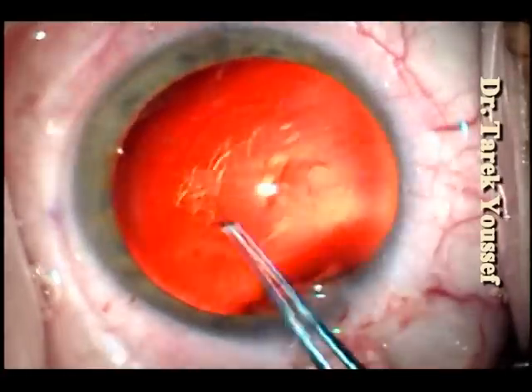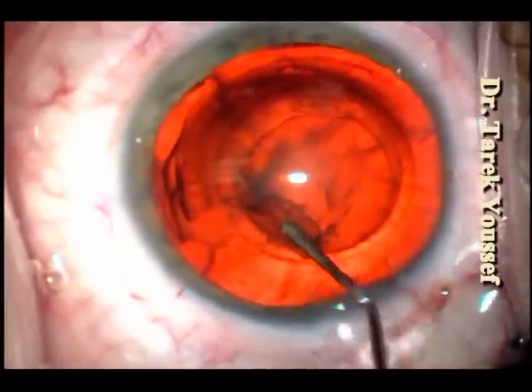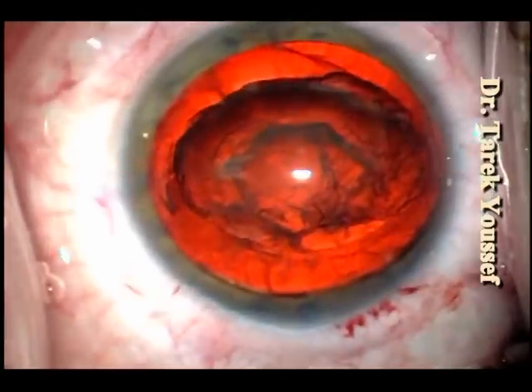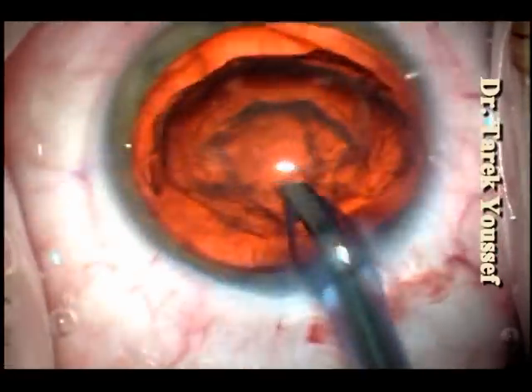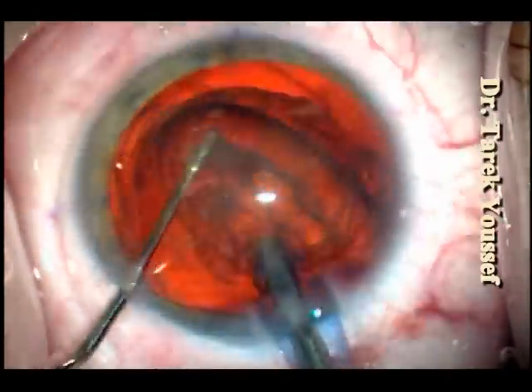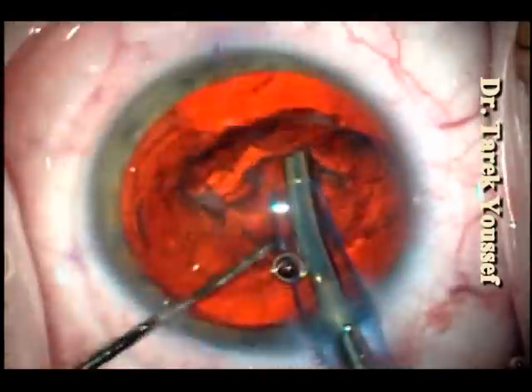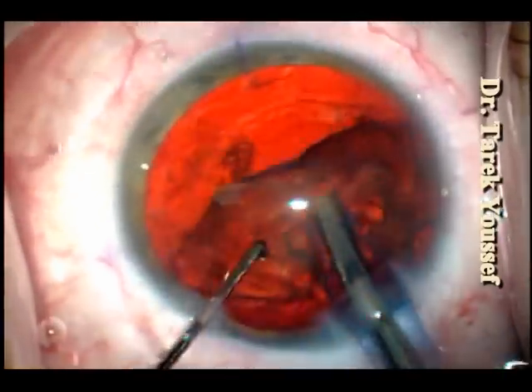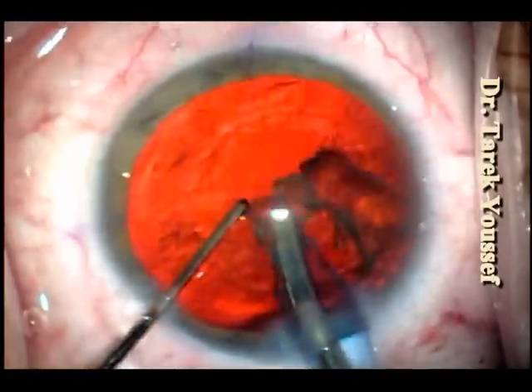This way we're trying to reach the stage where we don't need glasses for close up or for distance as much as we can. This step is hydrodissection, hydrodelineation, and nuclear rotation. Her cataract is not really dense because she's young — she's in her early 40s. Now I'll go with the phaco to remove the nucleus with the chopping technique, essentially dividing the nucleus into quadrants and removing it in parts. It's removed mainly with irrigation aspiration as the nucleus is too soft for a patient in the 40s. Her cataract is cortical and posterior subcapsular, which makes it very soft.